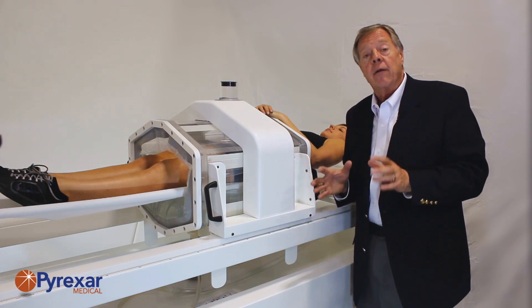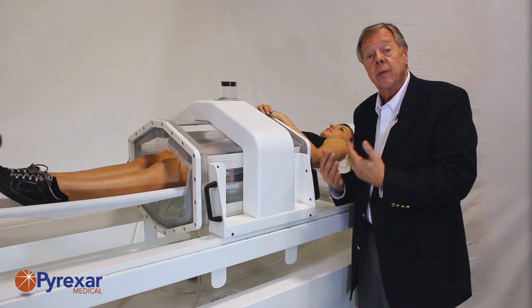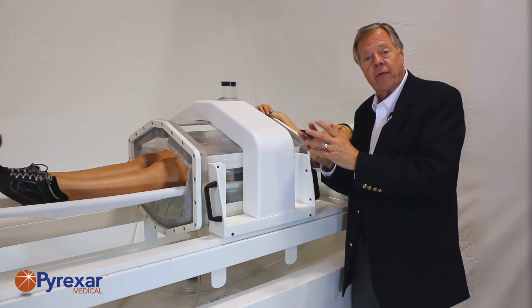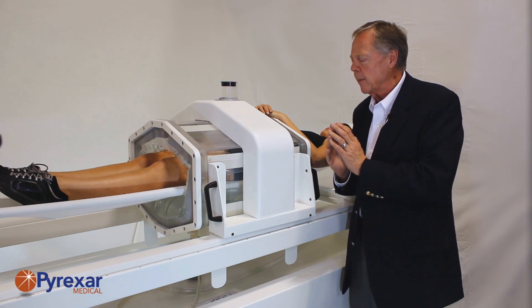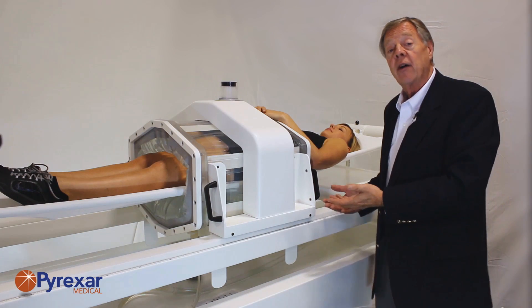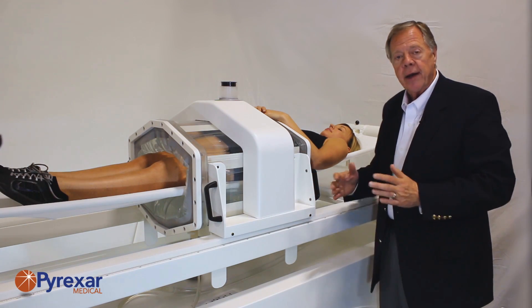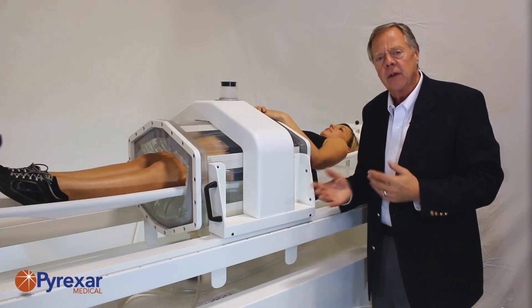The principle of using phased arrays is critical to focusing and targeting energy deep in the body. We transmit waves and adjust the phase of the different antennas so that the phase is common in the focal area we want to heat, creating phase nulls in other areas and intensification in the target tumor area. Once the water is filled and temperature sensors are placed to monitor and guide the treatment, we initiate RF power to raise the target tumor area to these high fever temperatures. Typically this process lasts around 60 minutes once the target temperature is reached, which usually takes around 10 to 15 minutes for most patients.